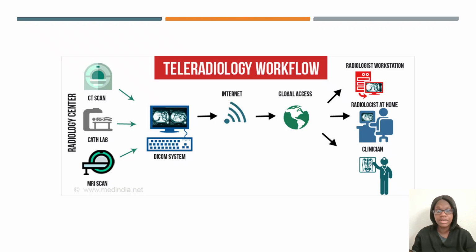So as long as they're keeping the patient's information private and confidential, following the HIPAA laws. Who knows where they're working, but I'm sure they probably have a lot of wires and computer systems set up for their teleradiology, maybe even cameras to make sure that they are the ones reading it. But it is an off-site location where they are reading these.